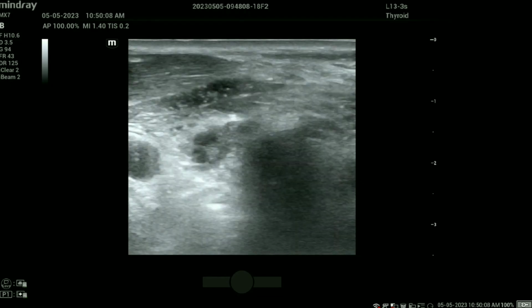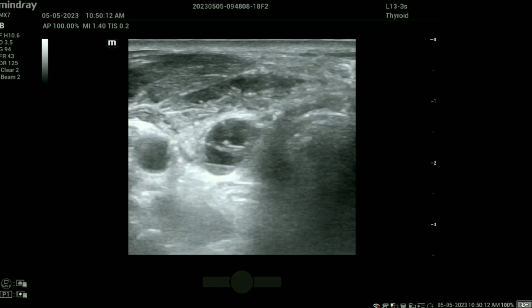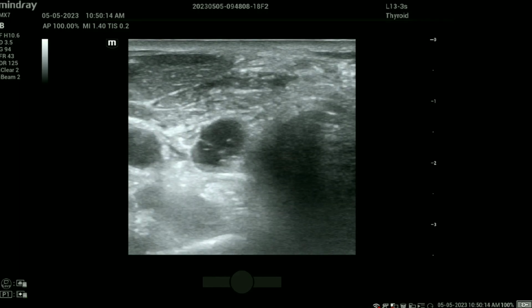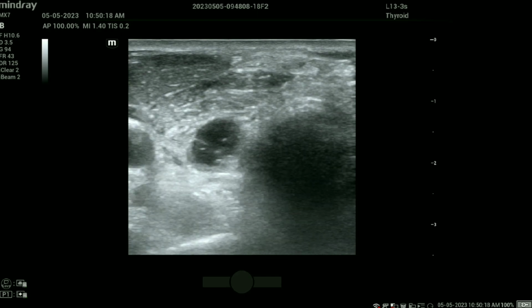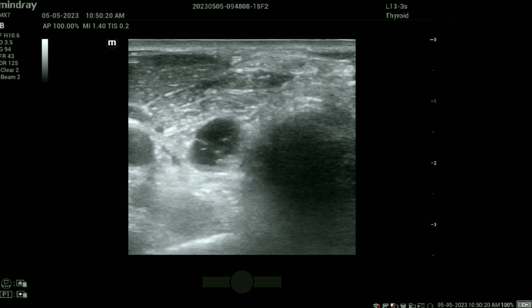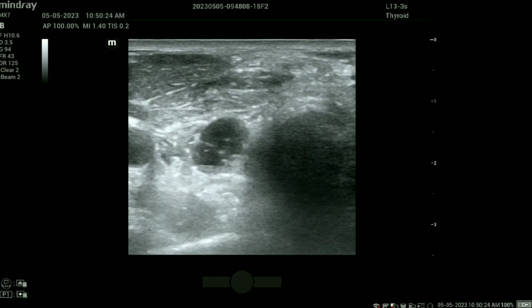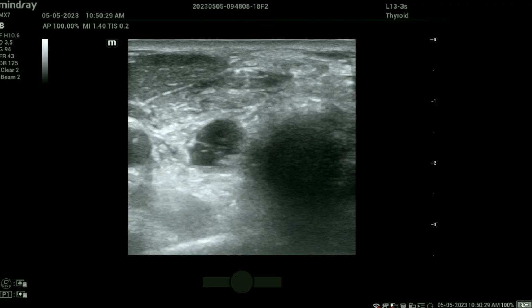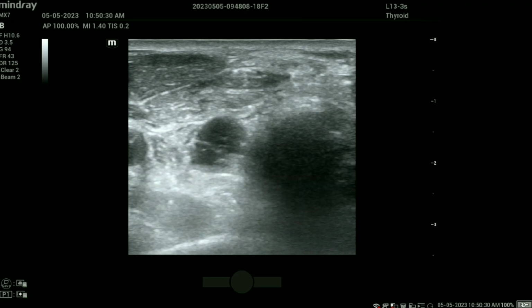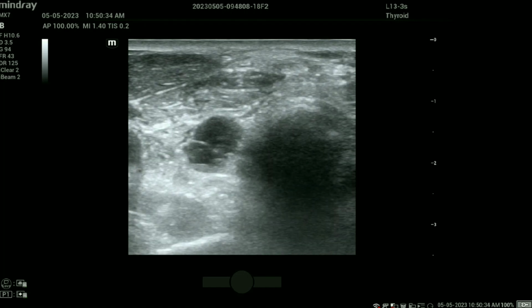Boluses were given between 3 to 5 cc's at a time under real-time ultrasonography. As noticed here, a separation is developing between the node and the tissue planes, and a gradual buffer zone is being created between the tracheoesophageal groove and the malignant lesion. A total of 25 cc's of cold D5W was utilized for this.